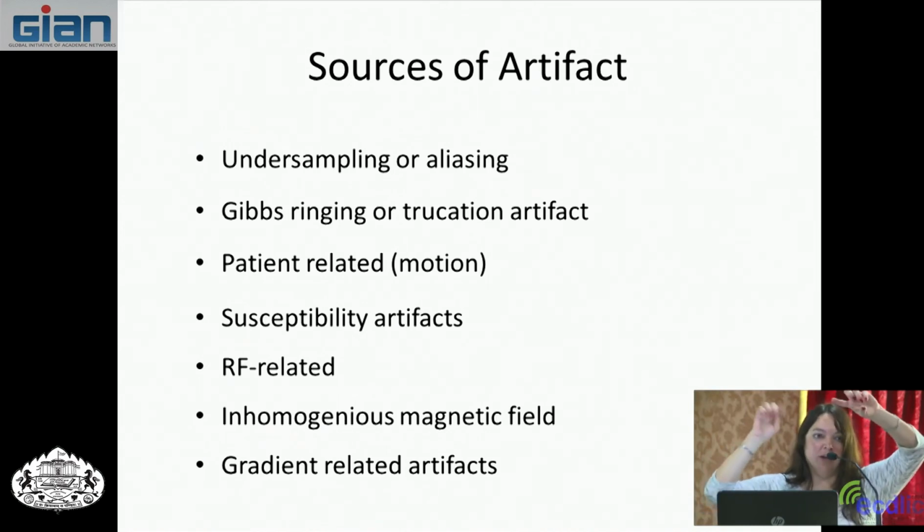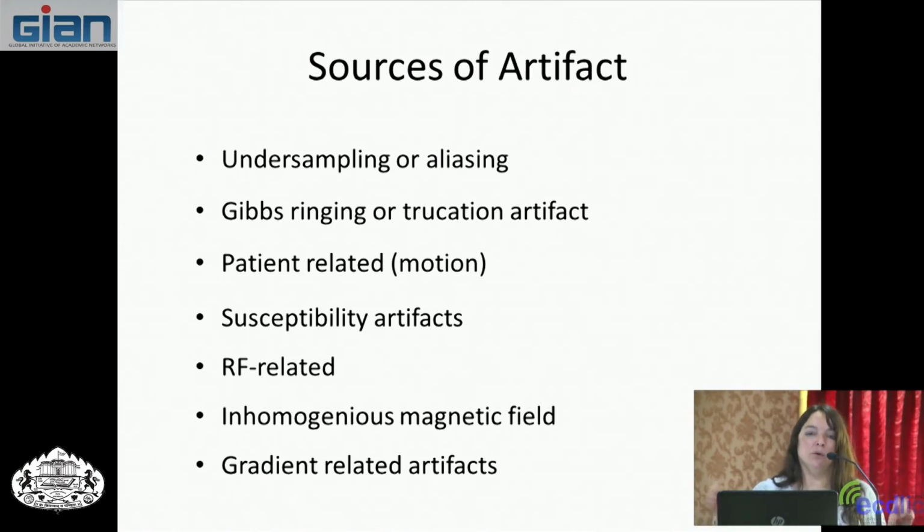Well, then you're not going to catch all these peaks and valleys. That's called undersampling. You're going to miss your frequencies because you're not sampling fast enough to catch all those ups and downs. That would be called undersampling or aliasing, and those cause problems whether you're doing a one-dimensional or a two-dimensional Fourier transform.